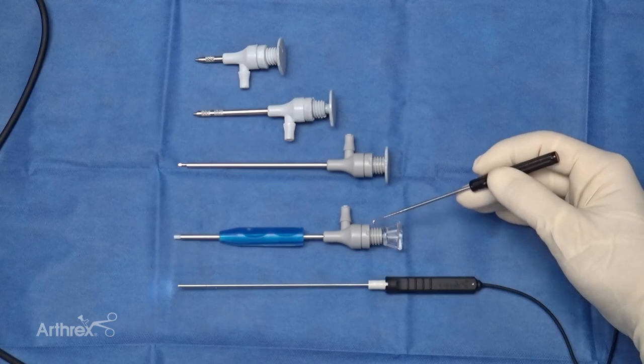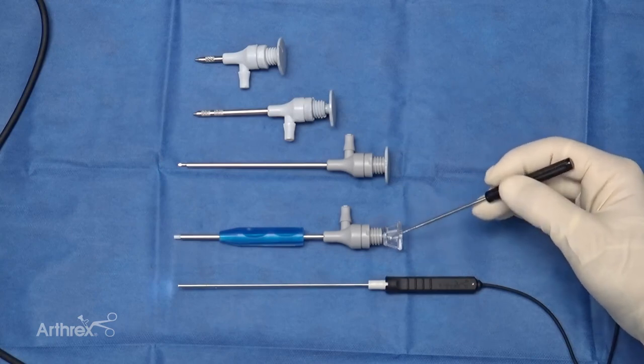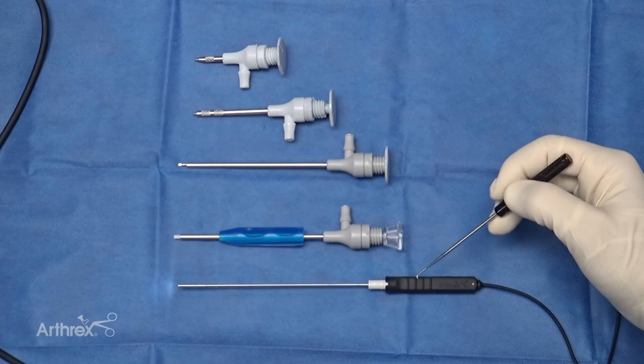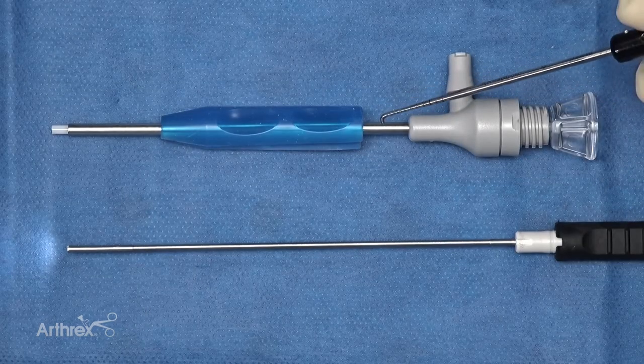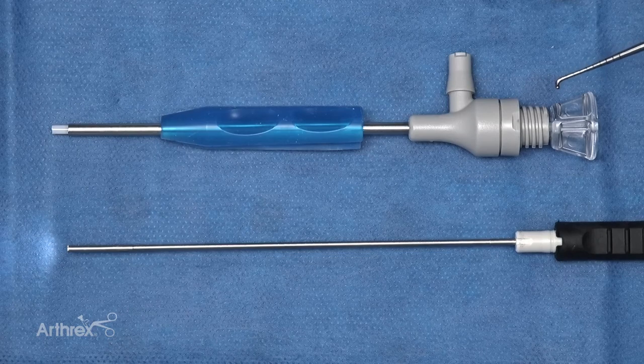The device is also much smaller and ergonomical. The surgeon can hold it in multiple different trajectories — either holding the hand piece or the pencil grip. Either one allows the surgeon to adjust their hand grip for what's comfortable, given the joint they're scoping at that time.